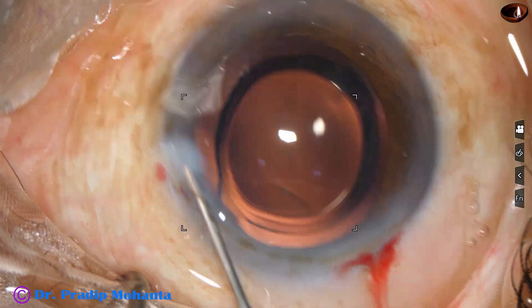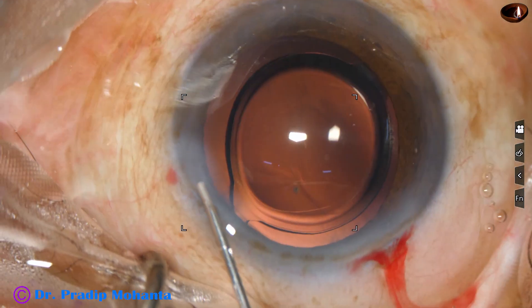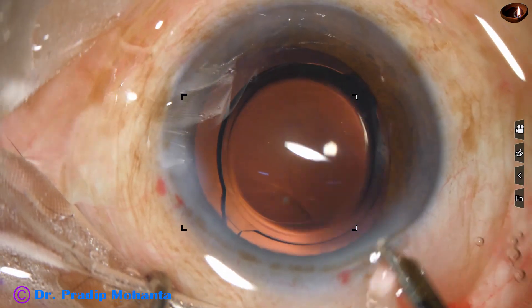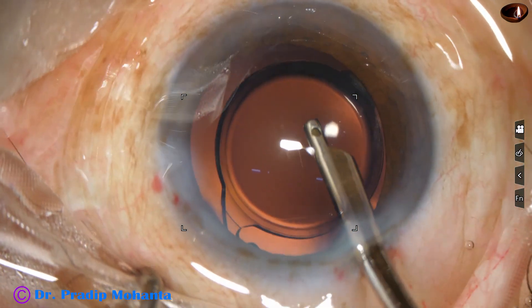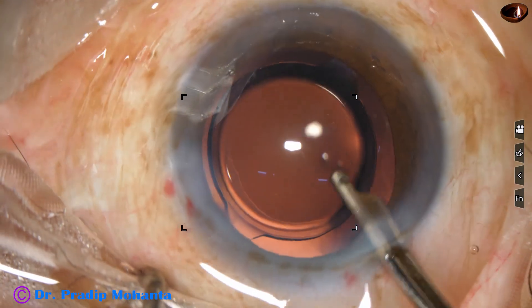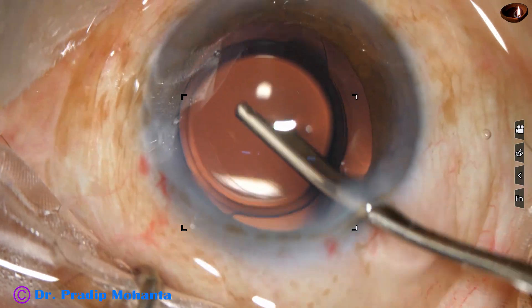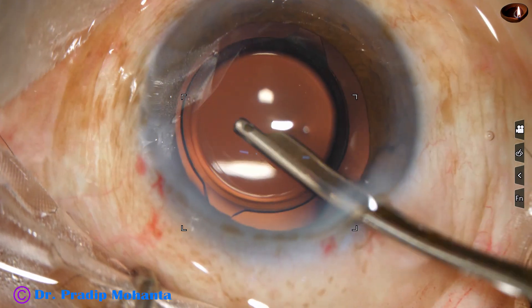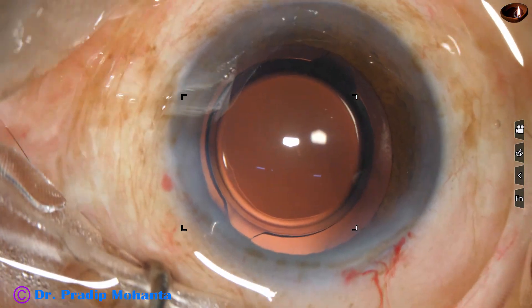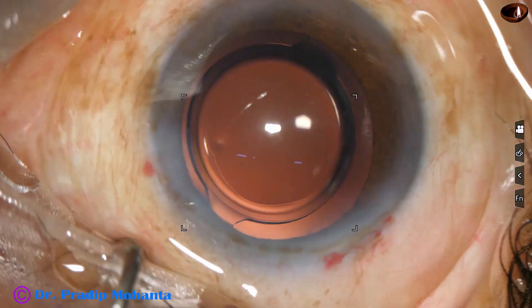This is closure of the side port. For the main wound, I need not hydrate because the wound has not been stretched at any time during the surgery. All the visco in the entire chamber is removed. Then I form the anterior chamber and check the wounds for any leakage. I put some drops of moxifloxacin over the ocular surface and conclude the case.